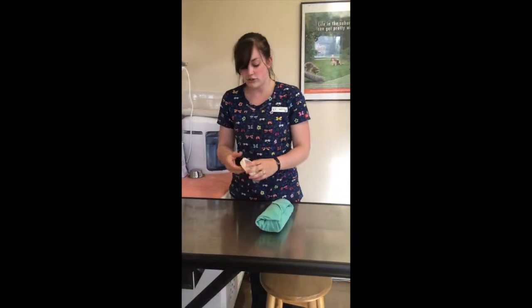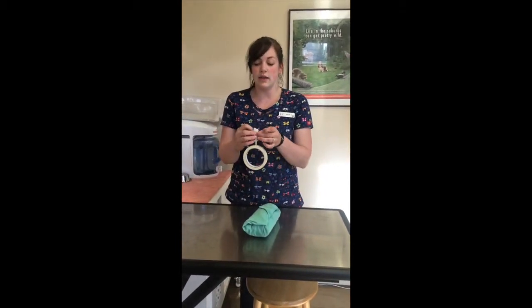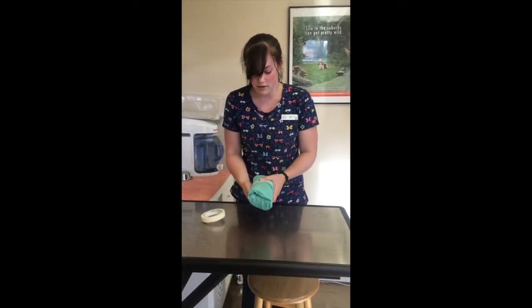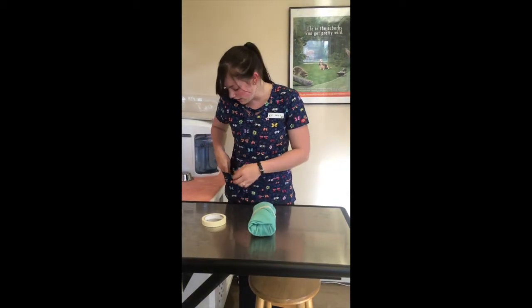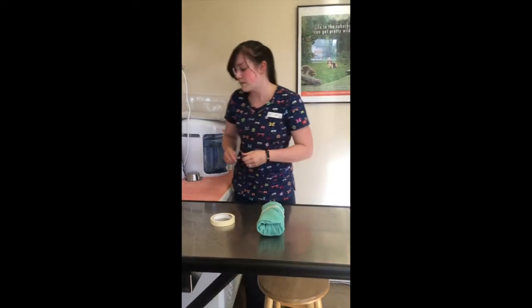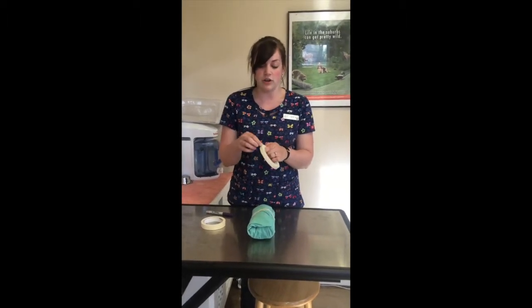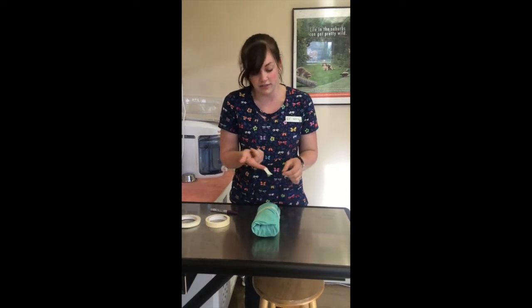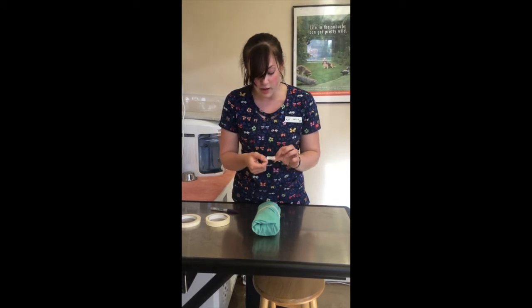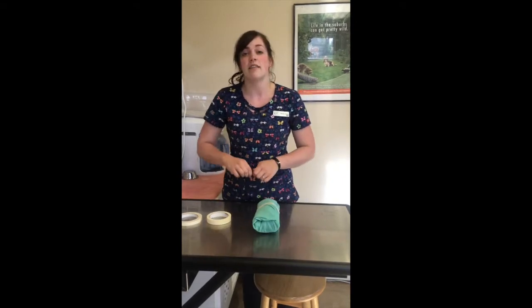So once that's done, you're good to go ahead and grab some tape, and you're going to want to label your pack. So make a little tab so it easily turns off. Alright. And you also want to put indicator tape on the outside of the pack. This will tell you if the pack was even sterilized. So this tape has these little lines on it, and when the pack has been autoclaved, these white lines will turn black. So that'll tell you that yes, it has gone through the autoclave, yes, it should be sterile.